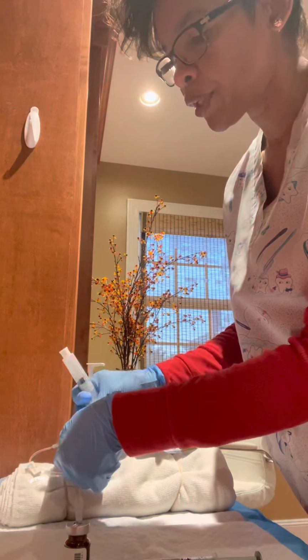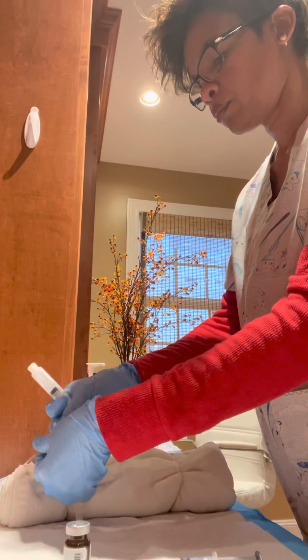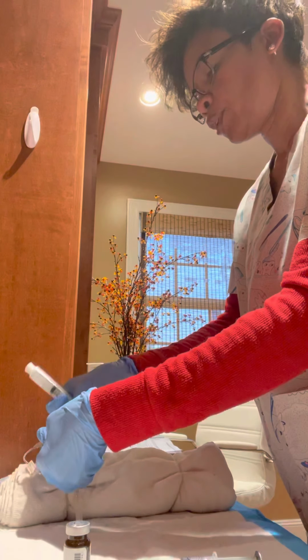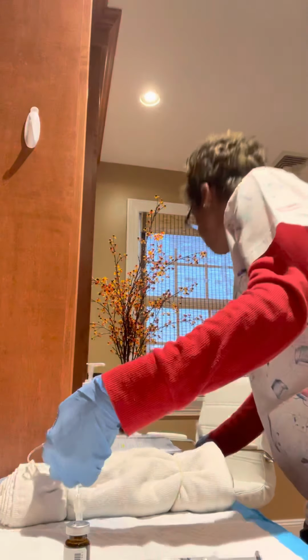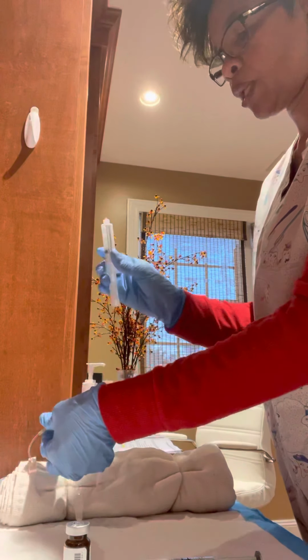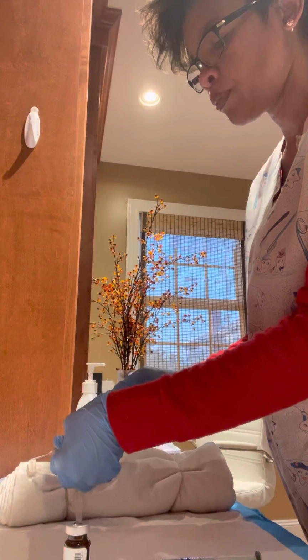Going to make sure it's unclamped as well. Okay, all right, so I'm going to clean it real well, and then I'm going to do 3 ml flush of the normal saline.